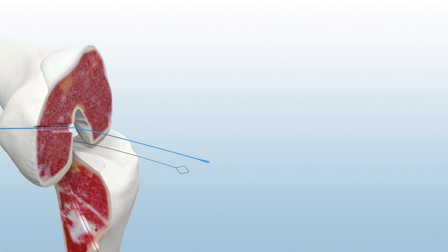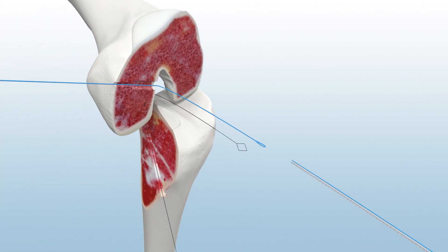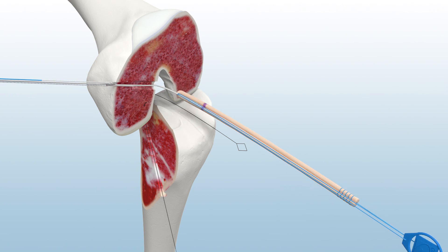To pass the graft, load the Infinity Femoral Adjustable Loop Button's lead and tensioning sutures onto the femoral passing suture. Under direct visualization, pull the lead sutures while removing slack from the tensioning sutures until the button is seated on the lateral femoral cortex.